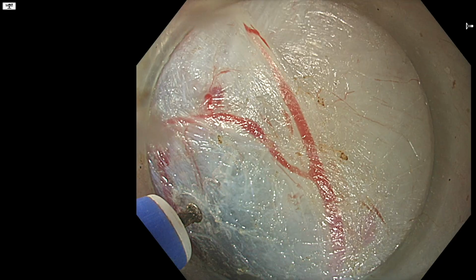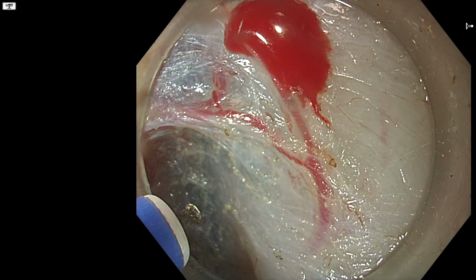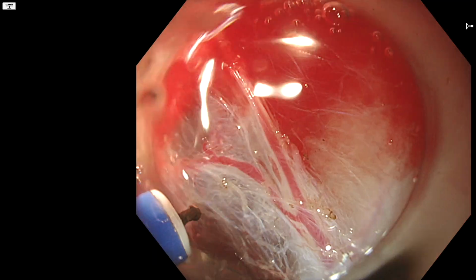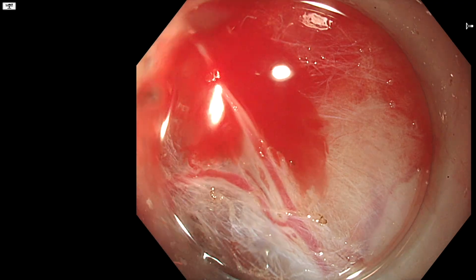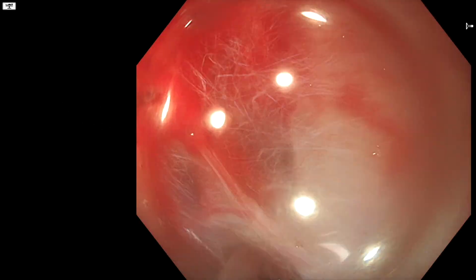Okay, so I'm playing this in slow motion just so you can see that sometimes the blunt dissection of the cap is sufficient to rupture a vessel. So fortunately this wasn't too large, but it's just something to bear in mind as well. If you're exerting too much pressure into the submucosa, a lot of times you will tear these vessels or the cap.